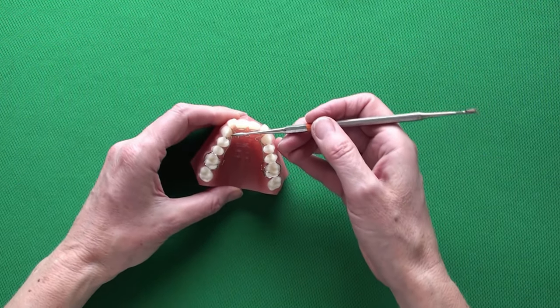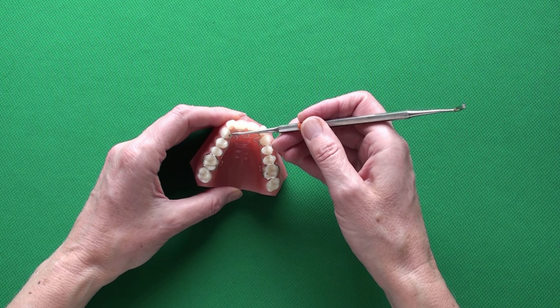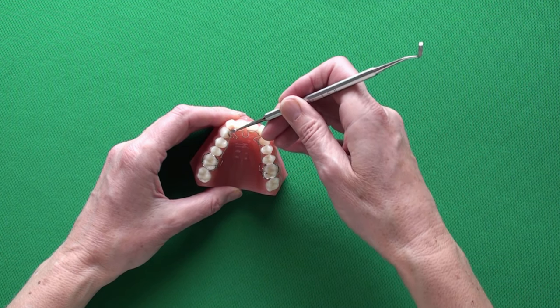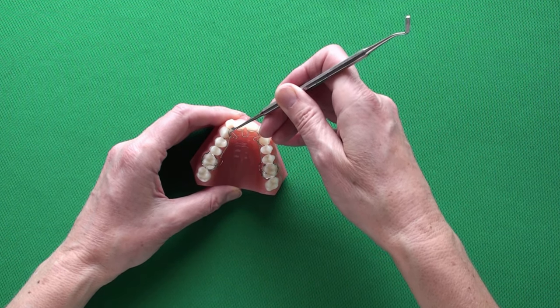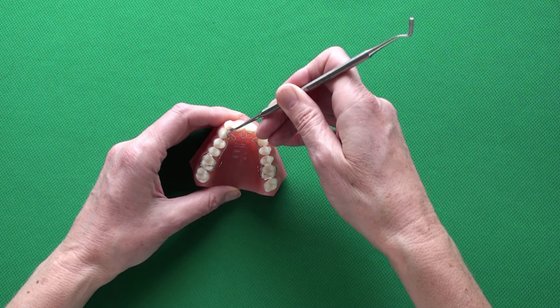The anterior part of the body wire needs to be worked in reverse to what you did on insertion. An instrument is used to pull the crescents towards lingual and incisal.